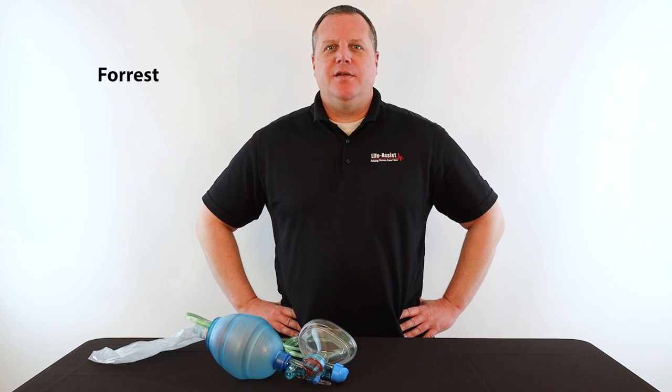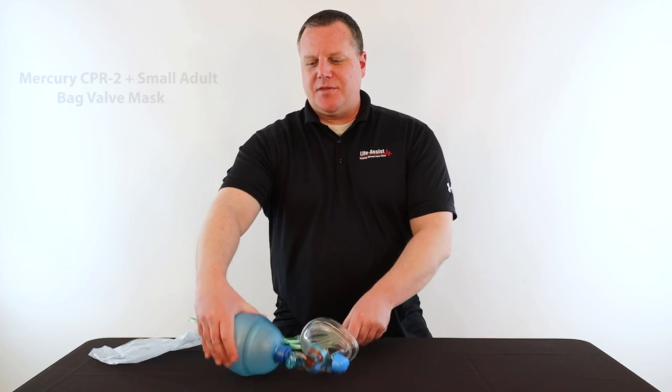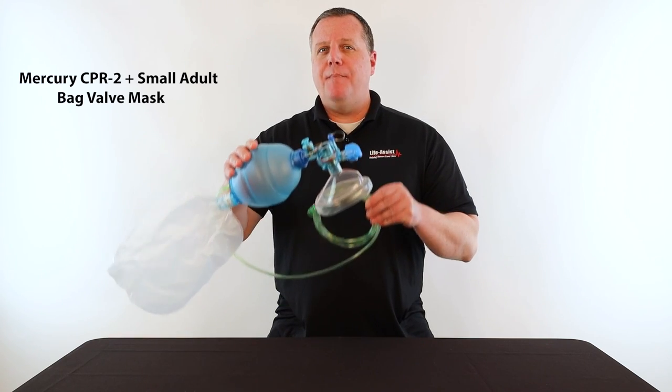Hello everyone, I'm Forrest Juhlin, Senior Product Specialist at LifeAssist and former paramedic. And today we are taking a look at the Mercury CPR2 Plus Small Adult Bag Valve Mask.